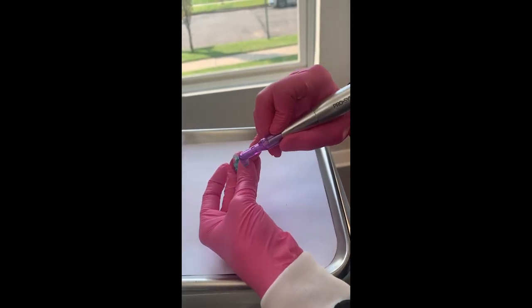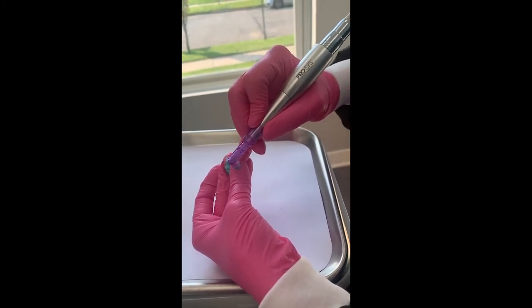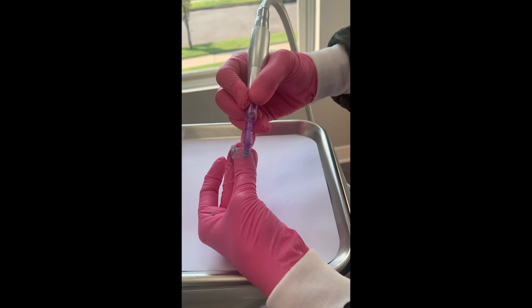I'm going to test it for pressure on my fingernail. I'm applying quite a bit of pressure here and it is not spewing out. I can move it around quite nicely there.